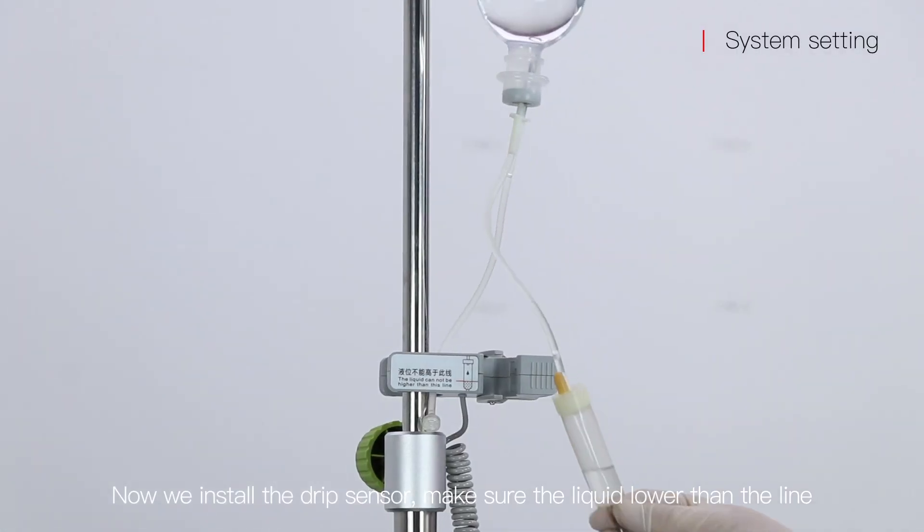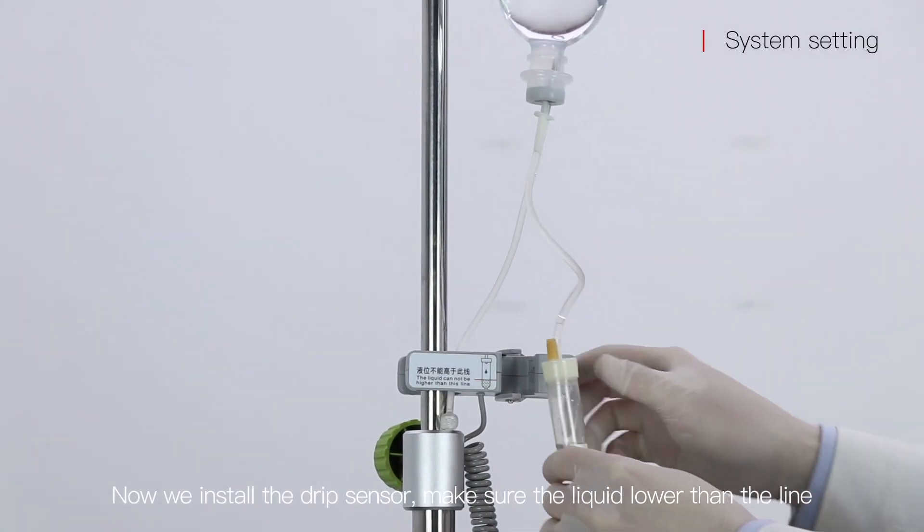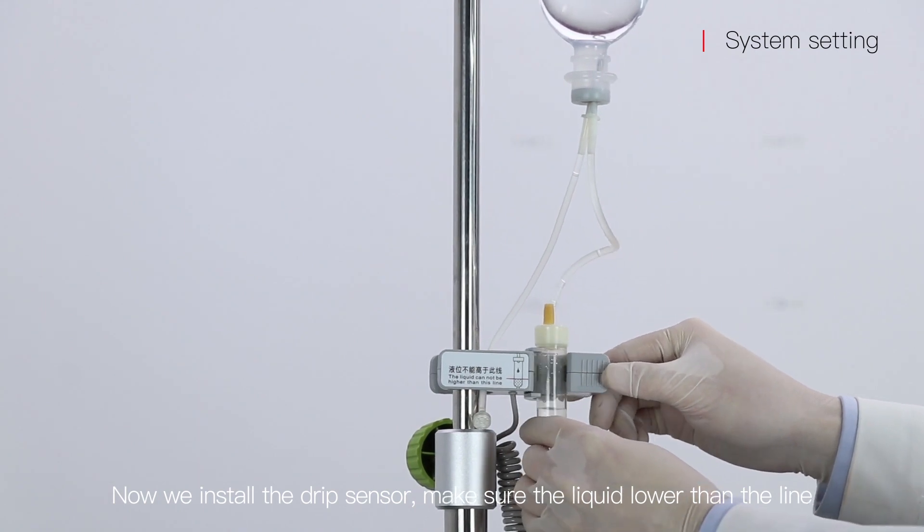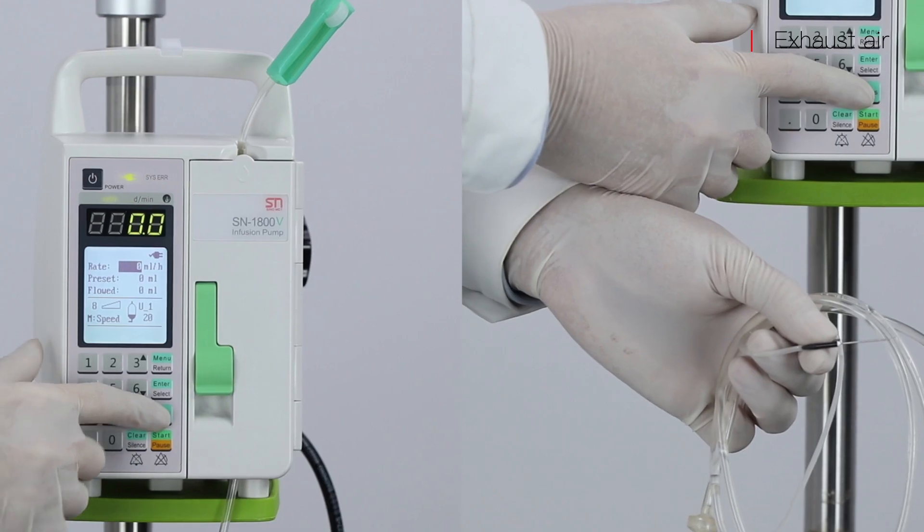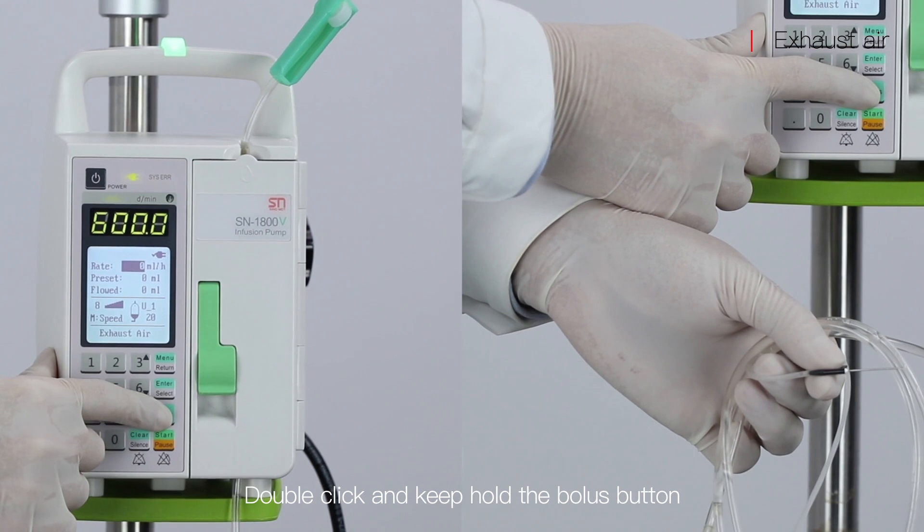Now we install the drip sensor, make sure the liquid is lower than the line. Double click and keep holding the bolus button.